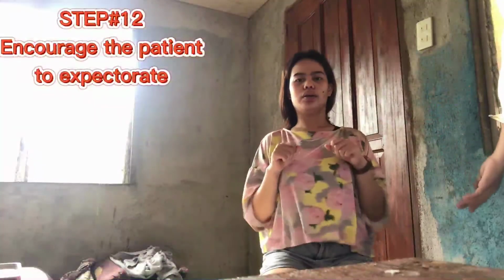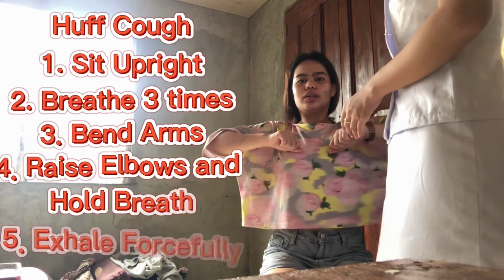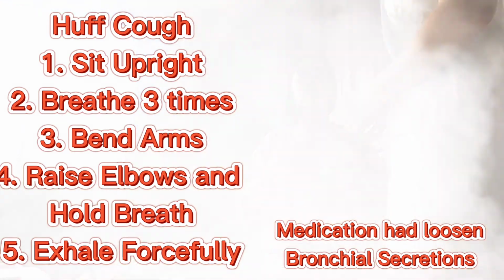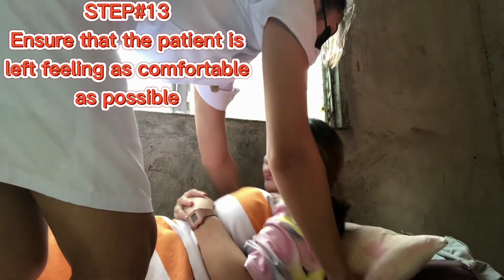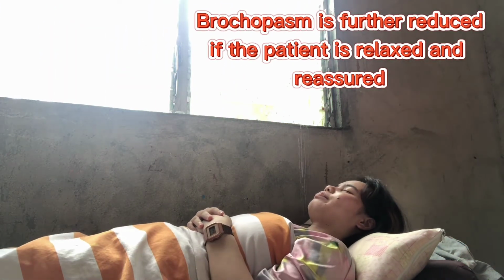Step number 12. Encourage the patient to expectorate, as the medication may help to loosen the bronchial secretions. Step number 13. Ensure that the patient is left feeling as comfortable as possible. Bronchospasm is further reduced if the patient is relaxed and reassured.